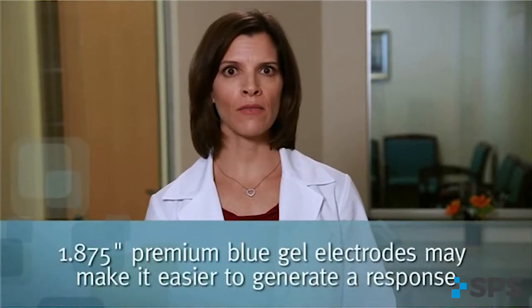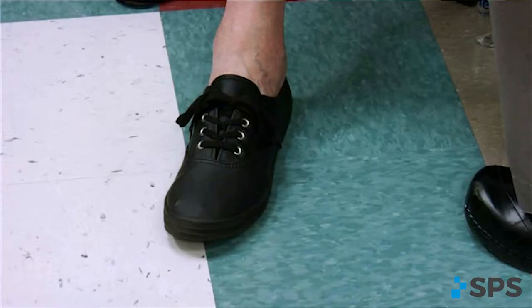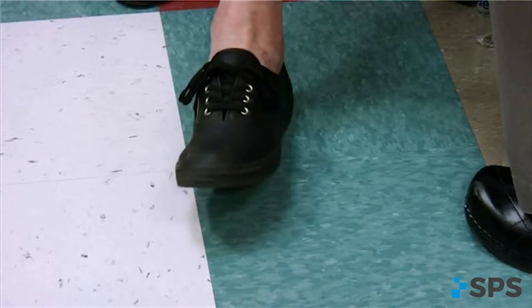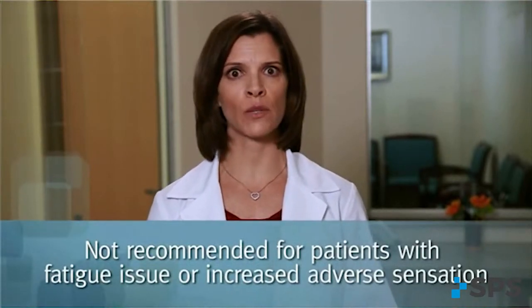The large 1.875 inch premium blue gel electrodes stimulate a broader surface area and make it easier to generate a response. They may also improve reproducibility, as the electrodes don't need to be as specifically positioned to produce the desired foot lift. Keep in mind that a large electrode covering a greater skin surface stimulates more fibers simultaneously with every step. Use caution when selecting these electrodes for patients with fatigue issues or if a patient complains of increased adverse sensation when using them.